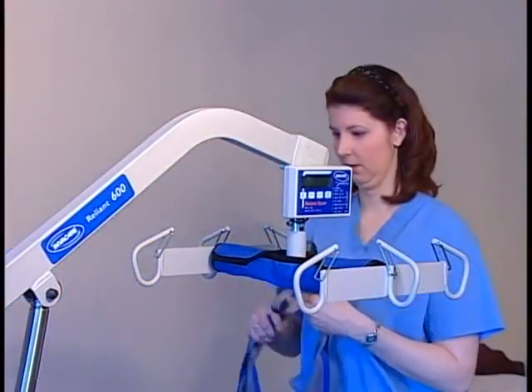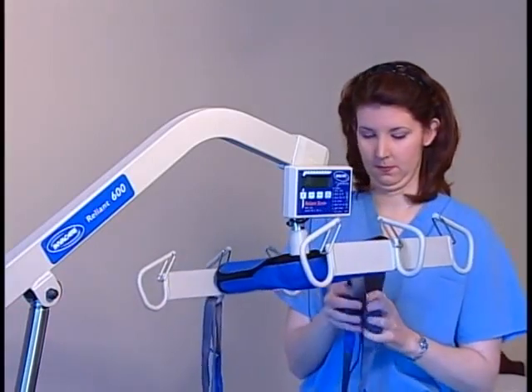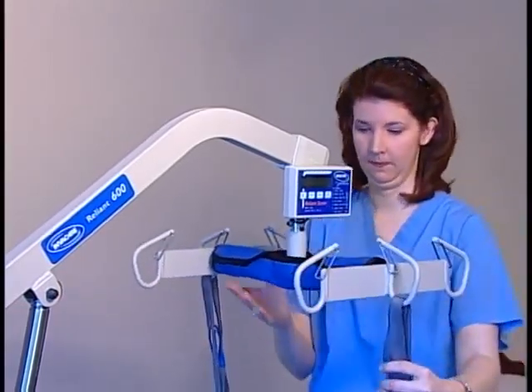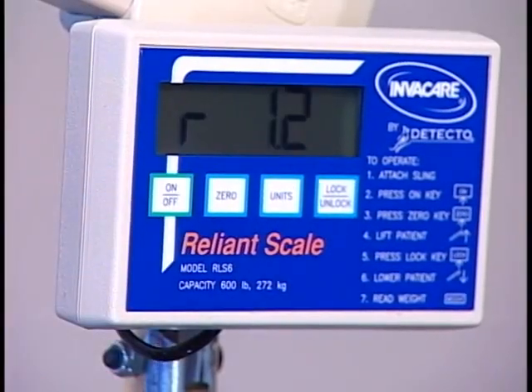Attach the empty sling to the swivel bar. To get the most accurate reading, it's a good idea to attach all sling straps to the center hooks on both sides of the swivel bar. Then press the ON-OFF key to turn the scale on.